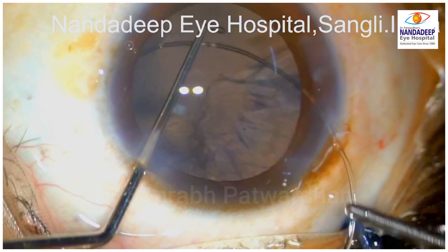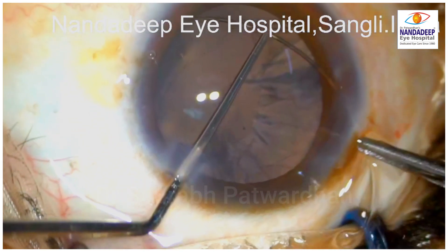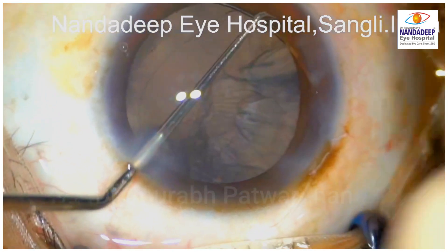You can notice that still there is some amount of cortex which is left in the bag. But as the bag was moving, the surgeon decided to put a capsular tension ring.